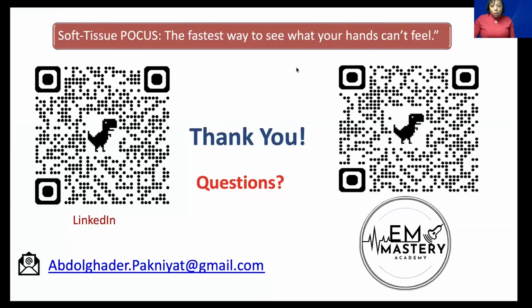Okay. The next question: what could make an abscess mimic cellulitis on ultrasound and lead to a false negative? Sometimes, if the abscess is very small and under thick skin, like the buttock, we may confuse the abscess with fat tissue. In very rare cases we have some misdiagnosis, we miss some small abscesses. The squish sign helps us not to miss them.